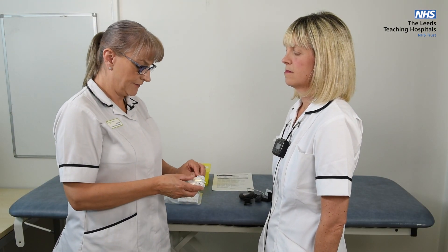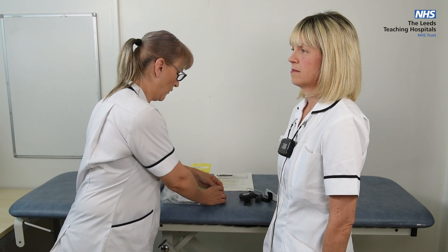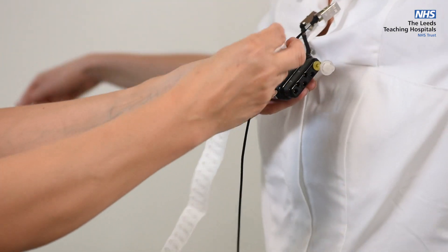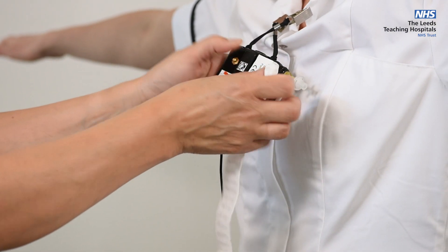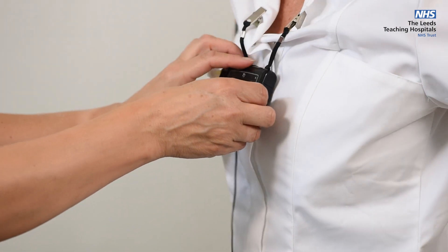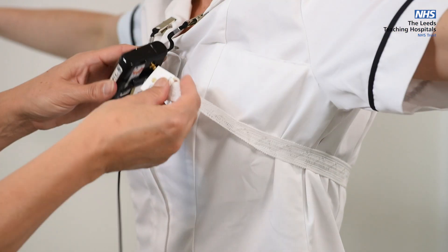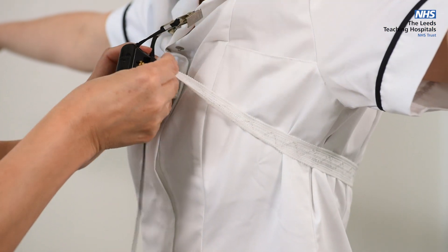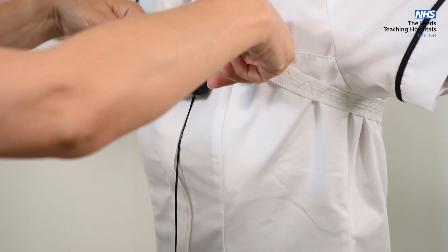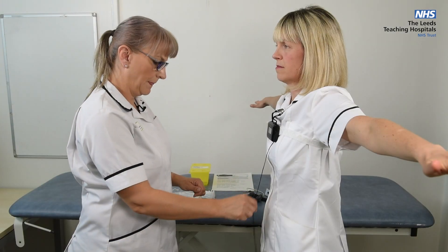Using the two bands, take one and attach to the press stud on the back of the device, then feed the band around under the arm, around the back, under the other arm, and attach onto the other press stud. Ensure that the band is evenly distributed around the body.